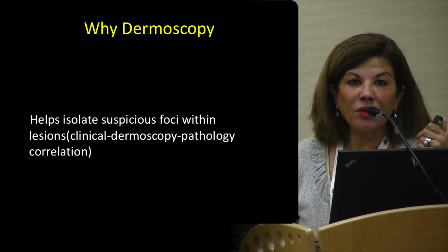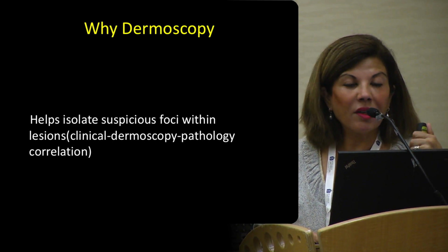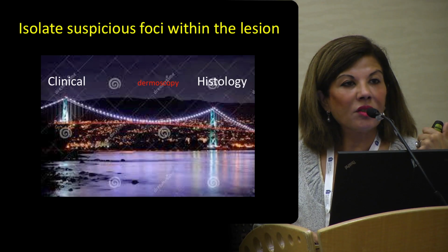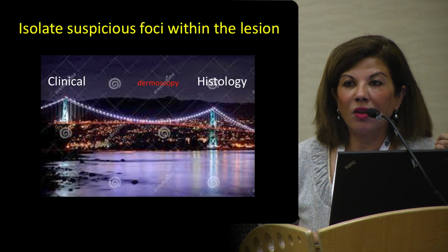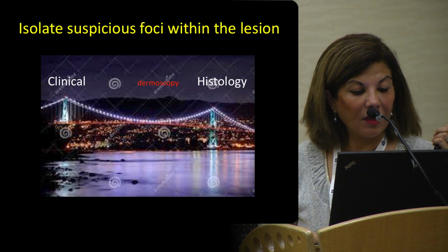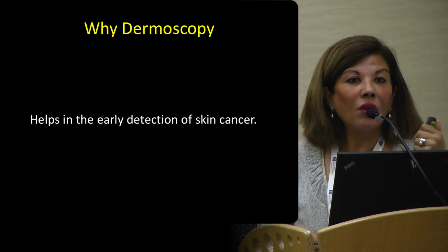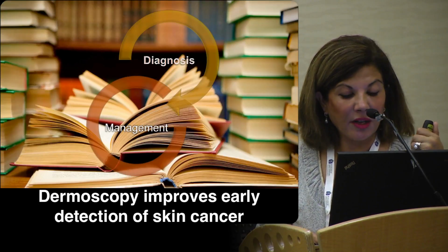Dermoscopy will help isolate suspicious foci within the lesions, so there will be a clinical, dermoscopy and pathology correlation. In other words, dermoscopy will bridge the gap between your clinical findings and your histopathological findings. Dermoscopy will help in the early detection of skin cancer, and this is all that we care about. An early detection of skin cancer will lead to improved survival.